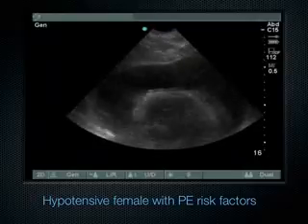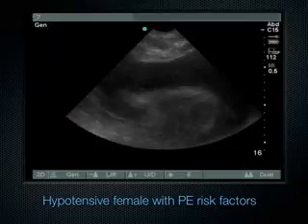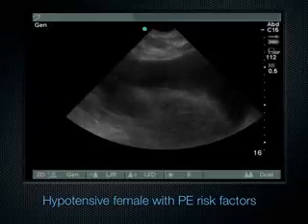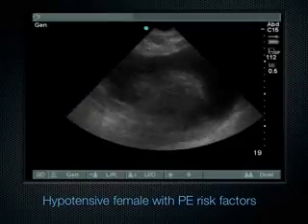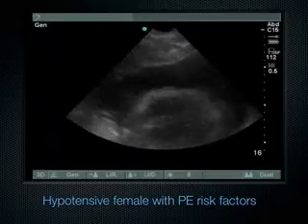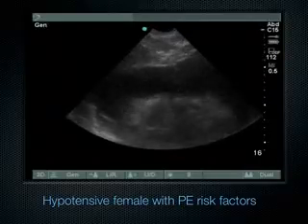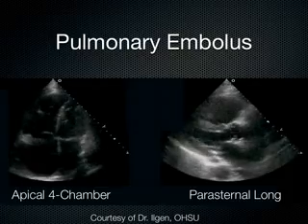So this patient did not get TPA. She got pericardiocentesis, and we drew off 700 cc's of fluid out of her pericardium, and it turned out she had lupus. And you know, if you took a little better history, you'd probably realize that. But at the time, dealing with the low amounts of data and time that we have in the emergency department, I think this is another really good reason to learn how to use ultrasound.